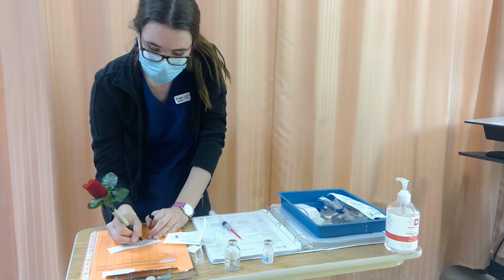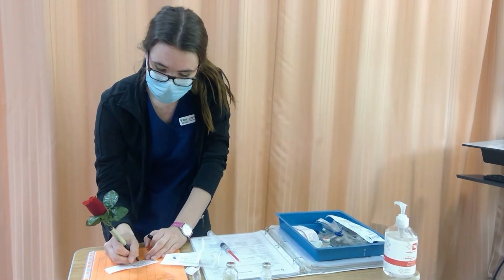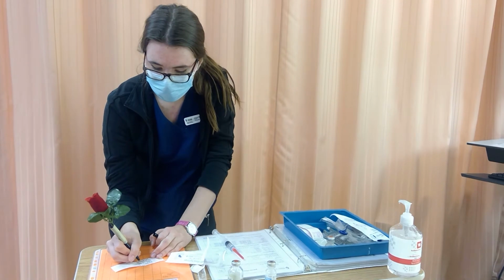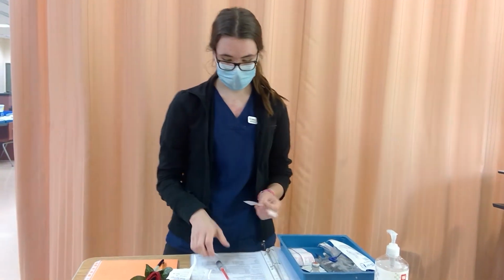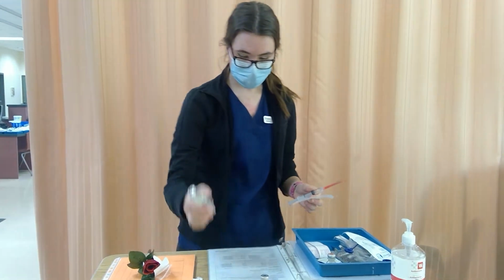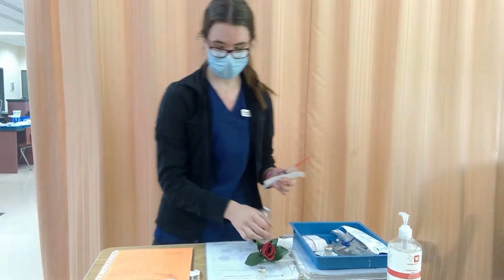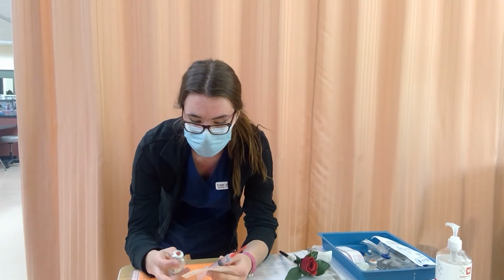Today is October the 20th, 2020. It's 12 o'clock. My name is Melannie Teitsma, Manitoba student nurse year 3, and that's it. So now that I have my label and my medication here, and my med vial, I'm going to be doing my second check. So I see my correct patient is verbalized.